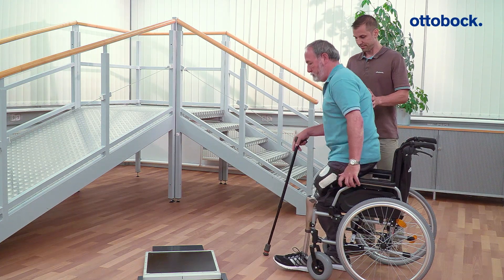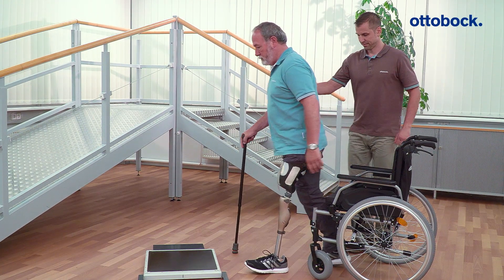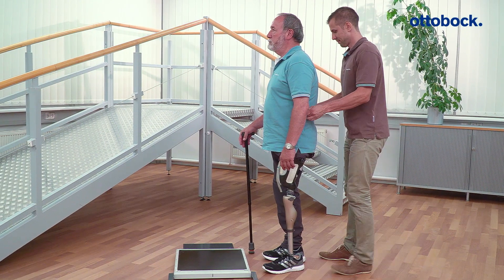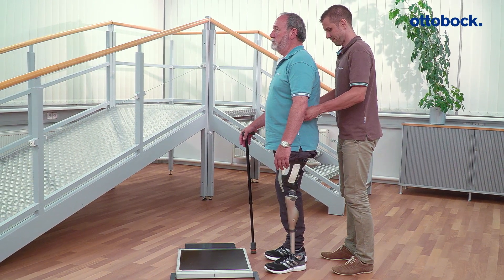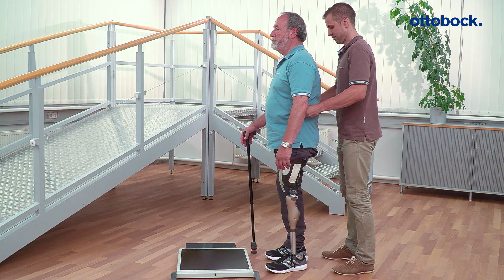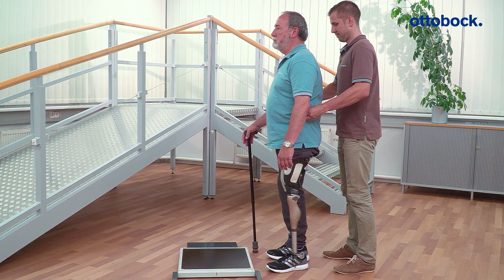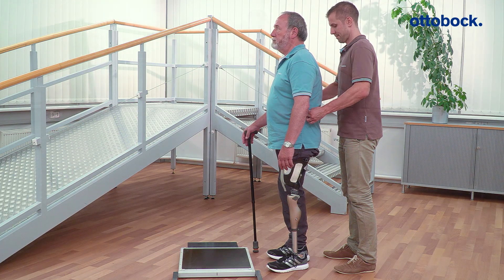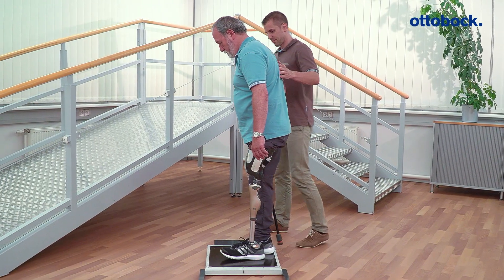Start the static alignment optimization by checking the length of the prosthesis. This can be done by using a pelvic level which is placed on the iliac crests with even pressure. Additionally, you can use the LAZAR posture or 3D LAZAR posture.